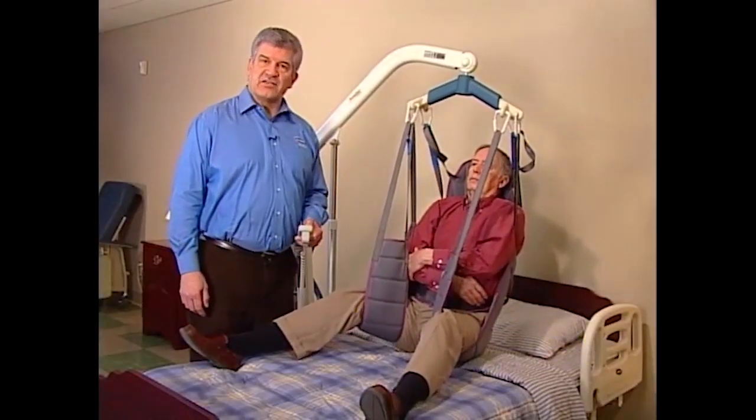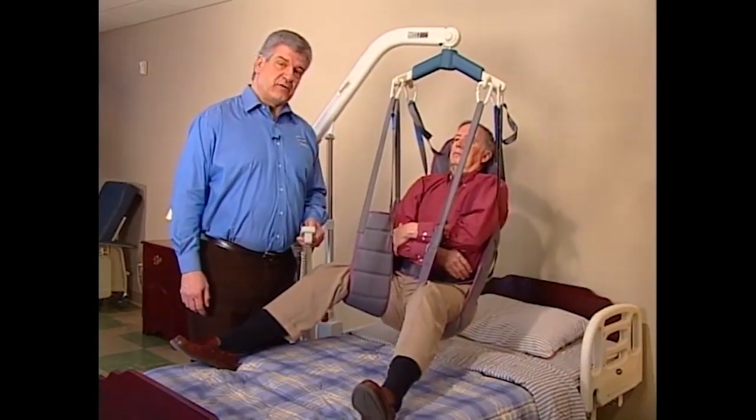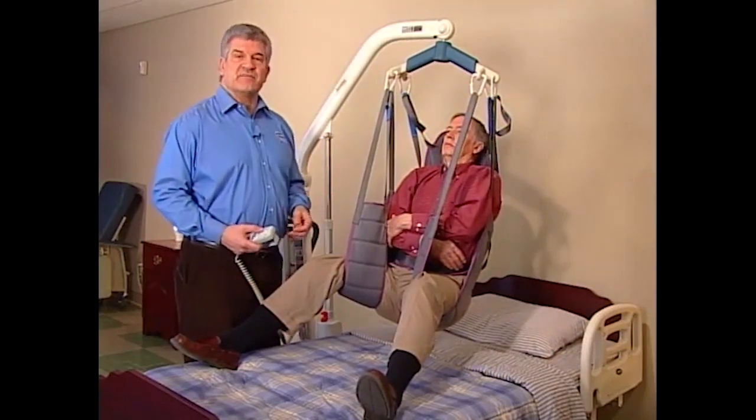InvaCare's toileting slings are designed to work with InvaCare full-body lifts: the Reliant 450, Reliant 600, and Jasmine. They're designed for easy placement and removal.